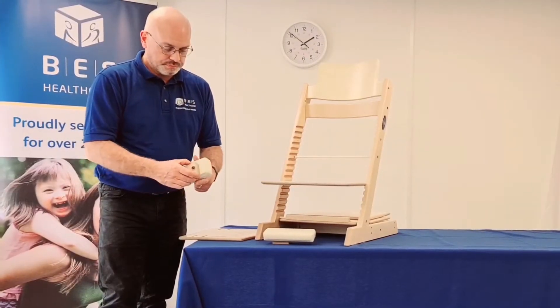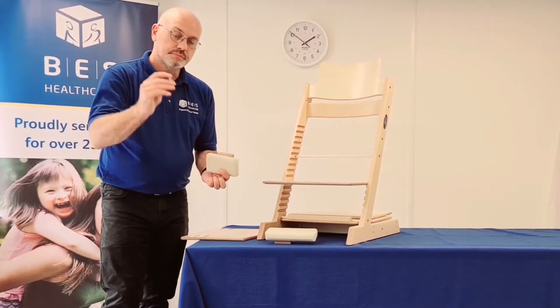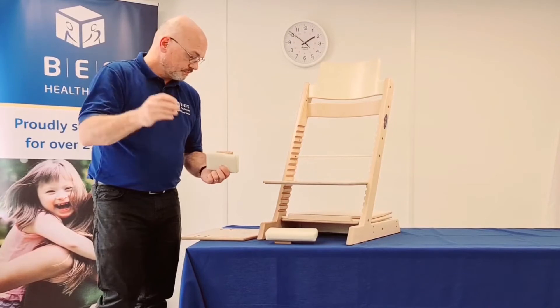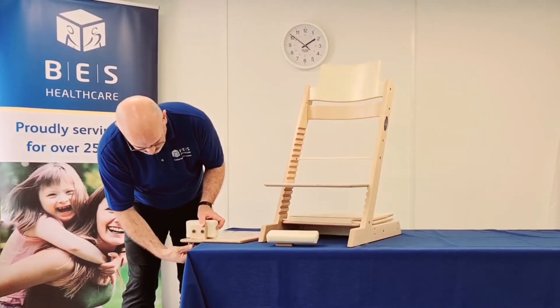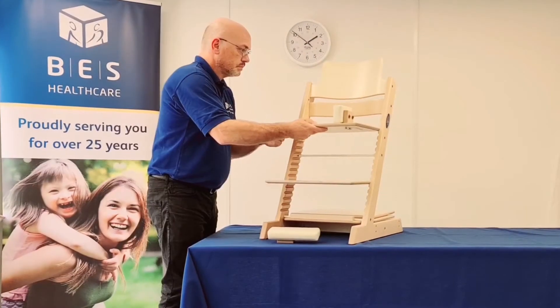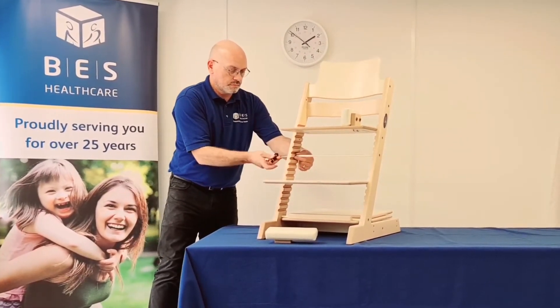Here we have the short thigh pad with mounting bracket and two attaching bolts. Simply pass the bolts through the slotted seat plate and loosely attach. From your measurements, or while the individual is seated, place to the required width and fully tighten.